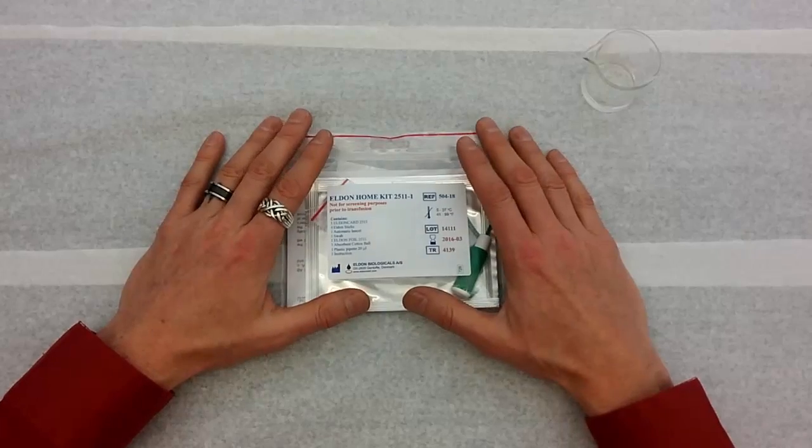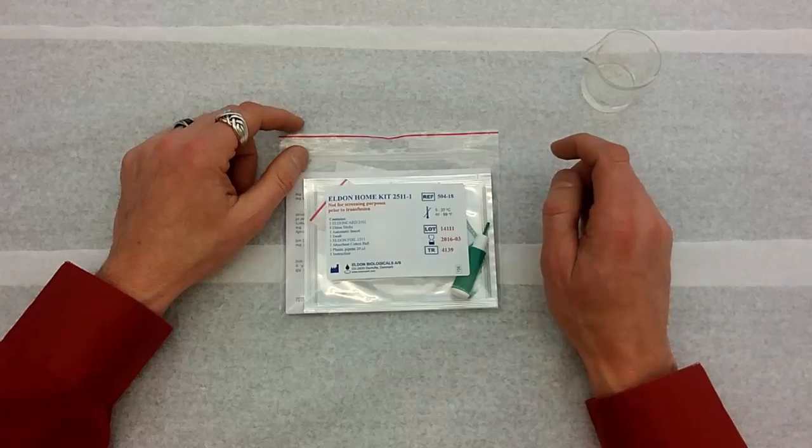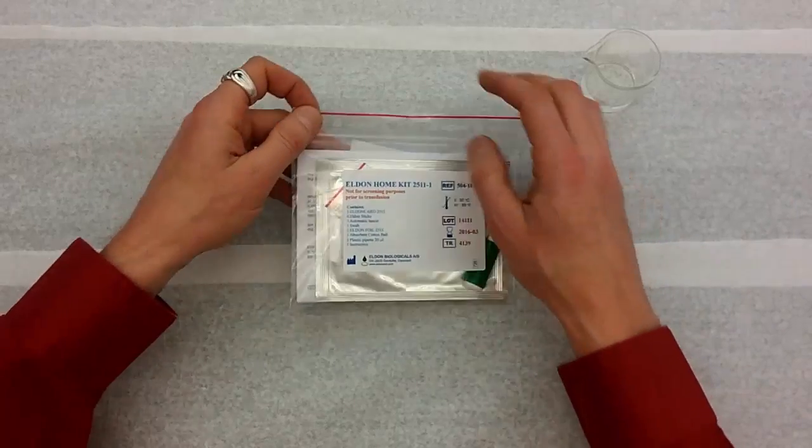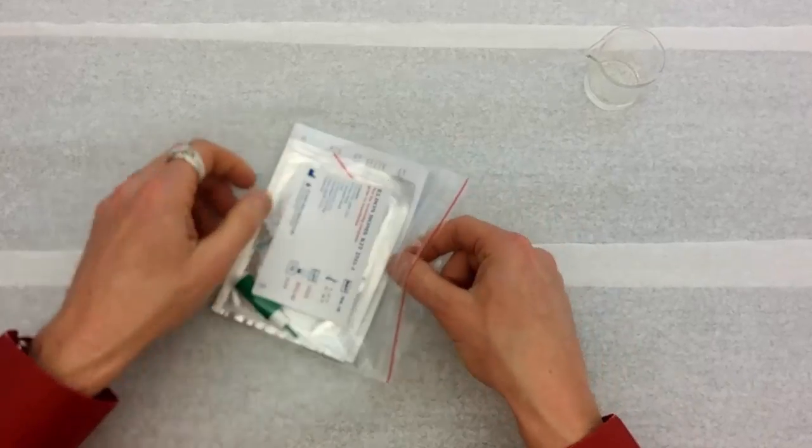Welcome to Anatomy and Physiology at Glen Oaks Community College. I'm Dr. Ren Hartung. For this video, I'm going to blood type myself to show you how to use one of these take home kits and talk to you a little bit about blood typing.